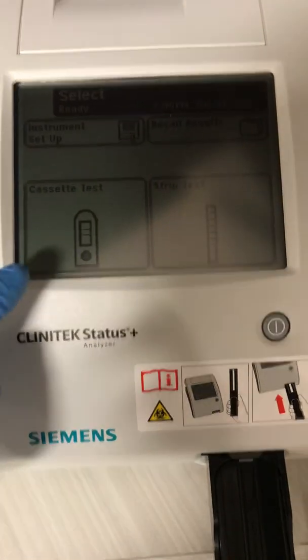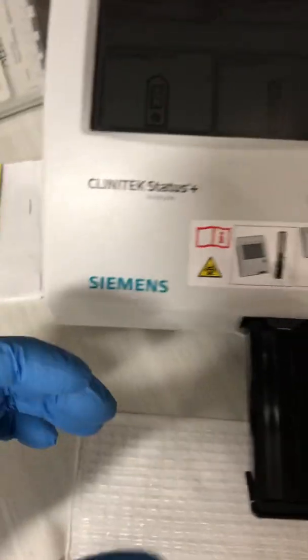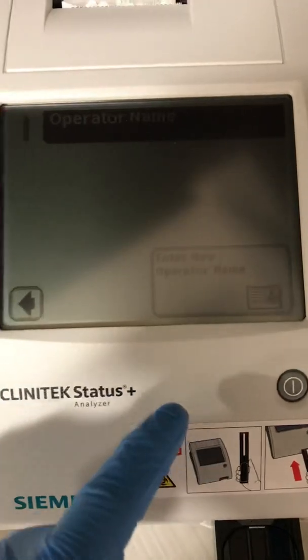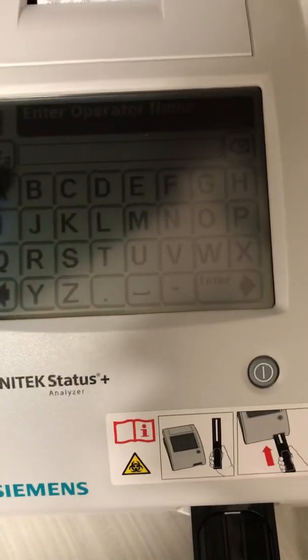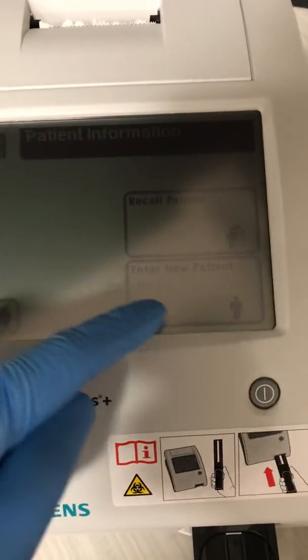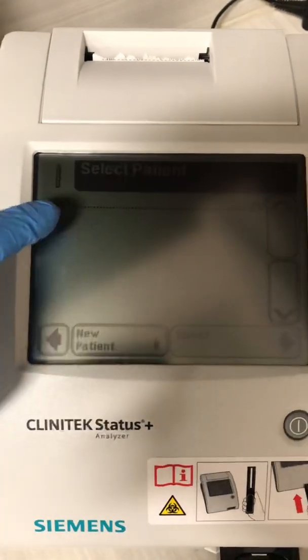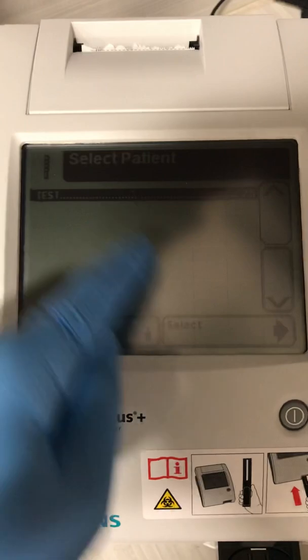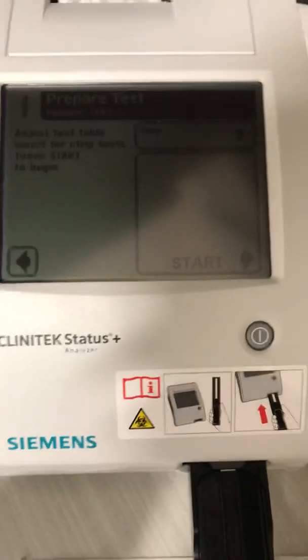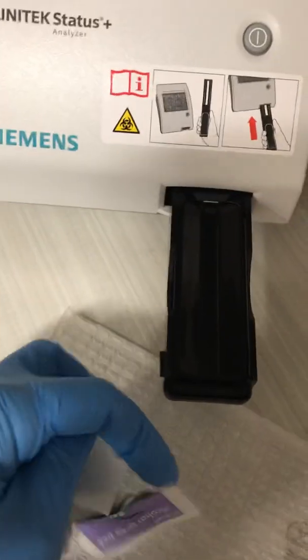After setup, it gives you two settings: cassette and strip test. We are using the strip test. Imagine you have a urine cup — you would select strip test. Then you put in the operator name, which would be my name, AJ, and press enter. Then you select a patient. You can enter a new patient, or select an existing one. I select the test patient I entered earlier, then click start.